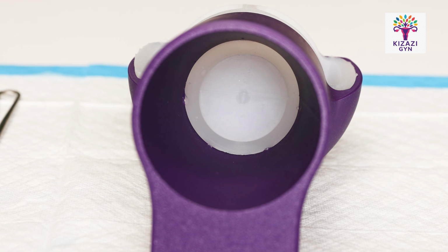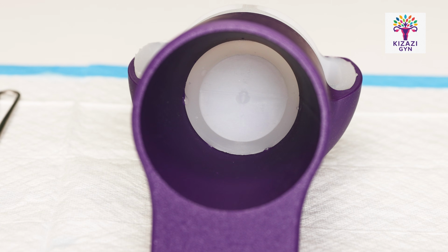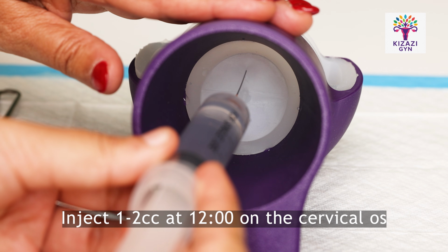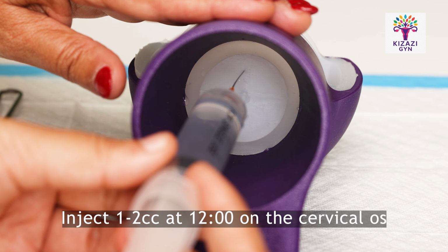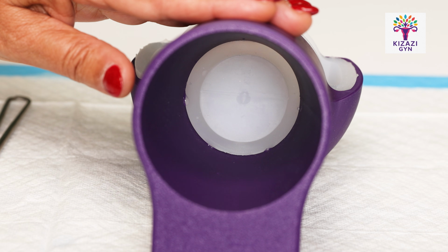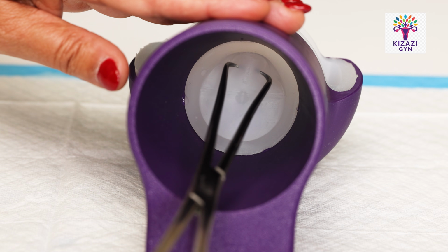Let's practice tenaculum placement. Most people, when they're placing their tenaculums, are placing it at the 12 o'clock position. What you're going to do is you're going to hub the bevel of the needle very superficially, just so the bevel is covered, and then you're going to practice injecting 1 to 2 cc's into the model. I don't actually recommend practicing on this model, injecting, because it'll squirt right back out at you. And then what you're going to do is you're going to go ahead and place your tenaculum.